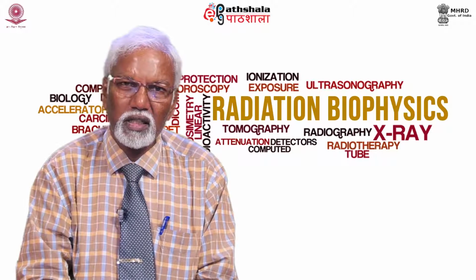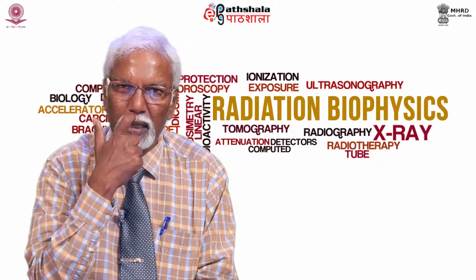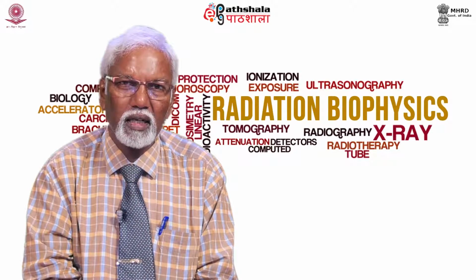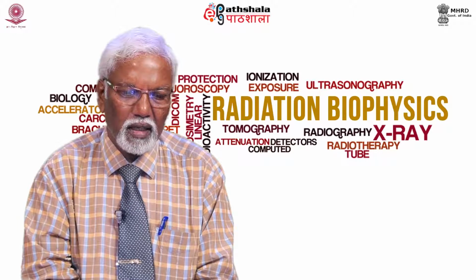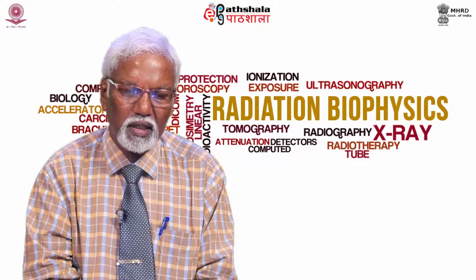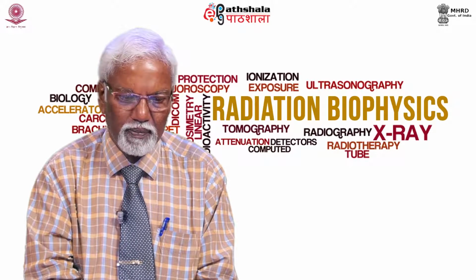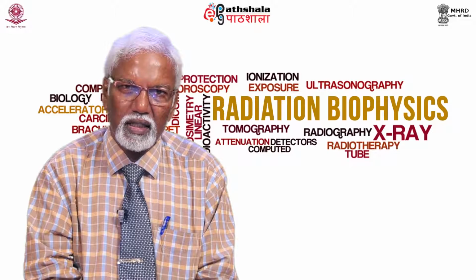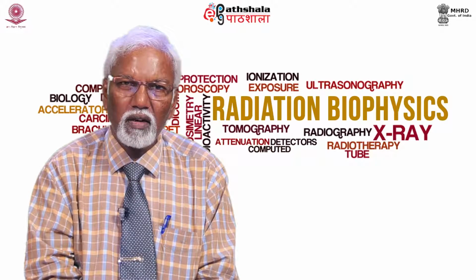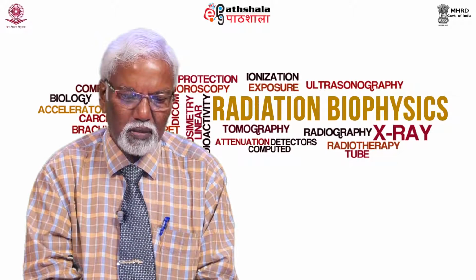So there was a constant search to find out the third dimension of the anatomy. CT scan came as an answer to that. It not only gives the three dimensions, it also avoids superimposition of images. And apart from that, CT scan also gives very good contrast resolution compared to radiography systems.